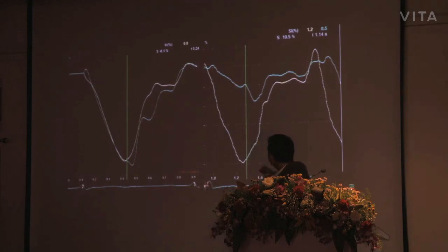This is seen in 30% of our myocardial segments. However, this curve is abnormal. Okay. You can see that this is a normal strain curve versus this strain curve, which is after the systole, is abnormal, and the amplitude is also abnormal. So if you find a normal amplitude strain with post-systolic shortening, we are fine, we are good. If you find the amplitude is small and there is significant post-systolic shortening, that is abnormal.